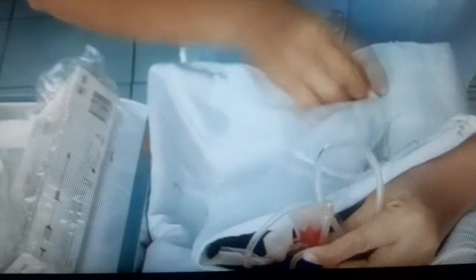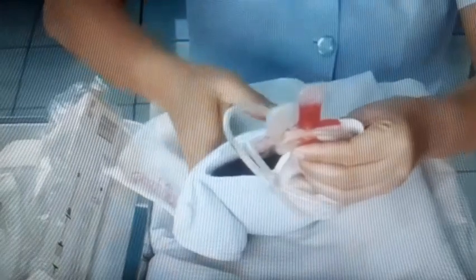Explain to the client what you are going to do, why it is necessary, and how he or she can cooperate. Explain the reason for the transfusion. Make sure you instruct the client to report promptly any sudden chills, nausea, itching, rashes, dyspnea, back pain, or any other unusual symptoms. Provide for client privacy and prepare the client.